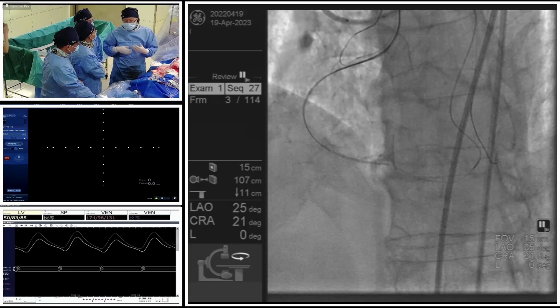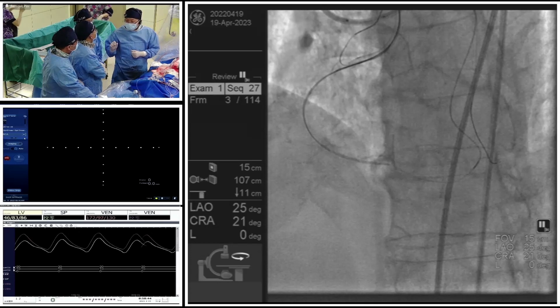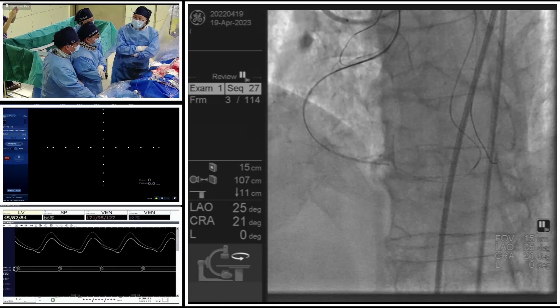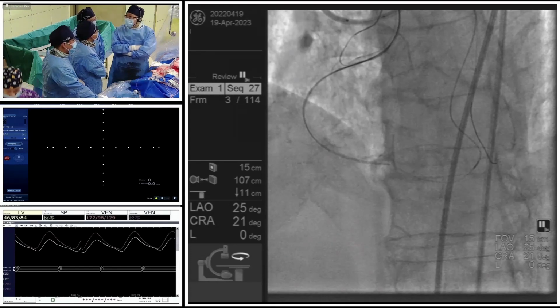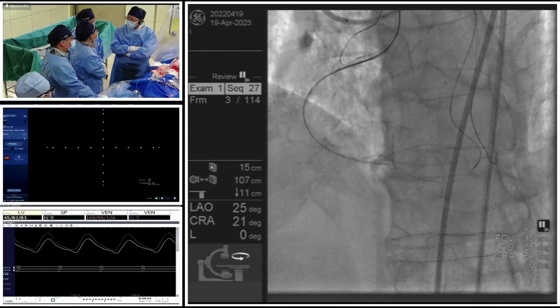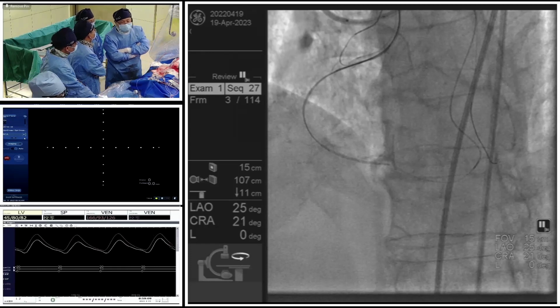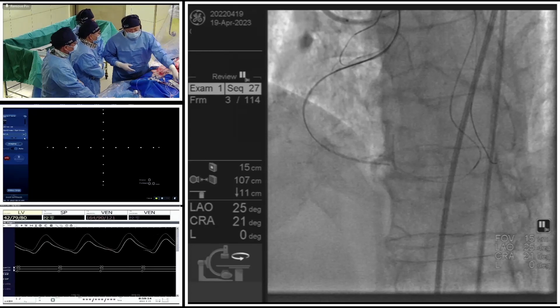And according to my experience, in most conditions about 2 to 3 absorbable sutures for embolization, then the coronary angiogram shows it is already sealed. So the function is just like the coil, but the coil has cost and is very ugly. So certainly we already published our experience. So audience, if you want to try this technique, you could read the article.